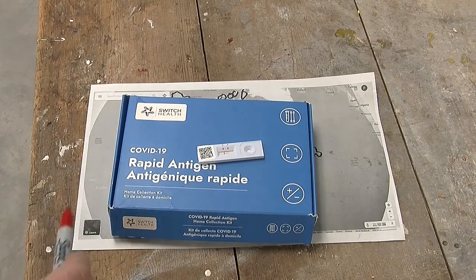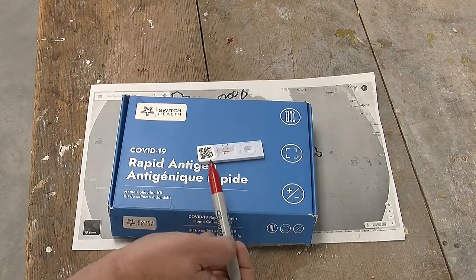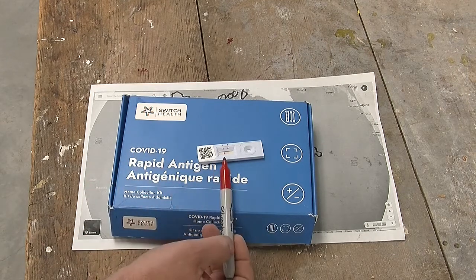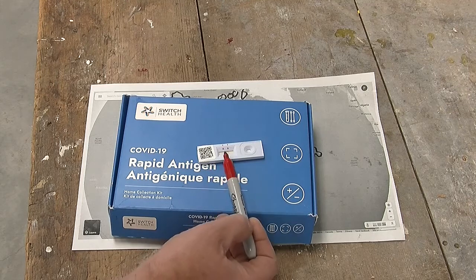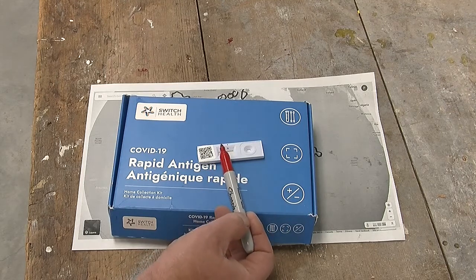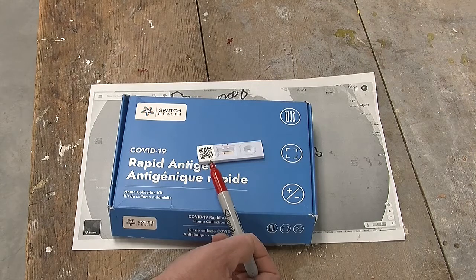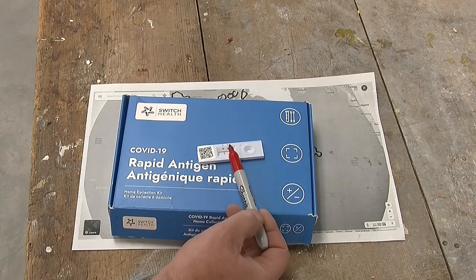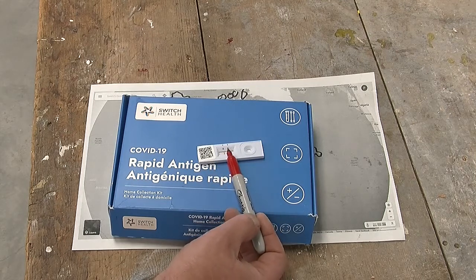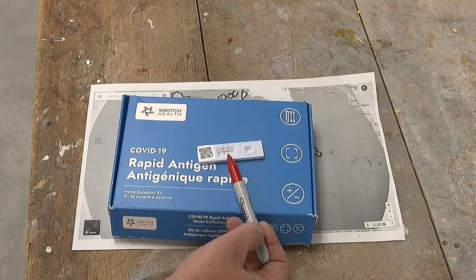And I don't really want to talk about this test too much other than kind of poor human interface design. There are two potential lines on the test. C stands for control, and if a line appears, it means the test is functioning properly, and then T is the test result, and if a line had appeared there, it would have been a positive detection of COVID.